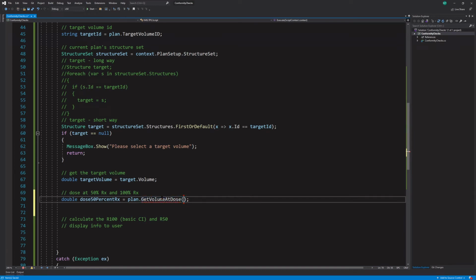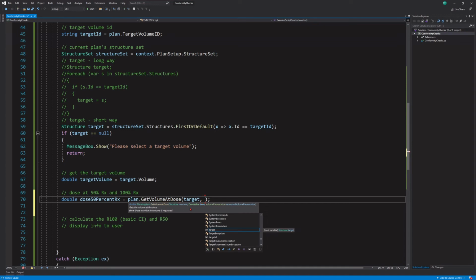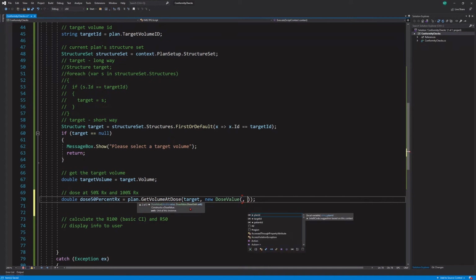This is a method, and it's going to take some parameters. In order to see the parameters, I just typed a comma, but you could also just hover over it, and it would tell you. All right, so we need a structure. We have that, we have the target, right? And then we need a volume. No, we need a dose value. So let's say new dose value, because we can declare it inside, and a new dose value needs a value, so a double value. Let's say 50, because we want the dose at 50%, and then it needs a dose unit. So we need a dose value.